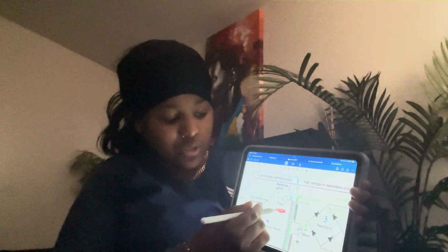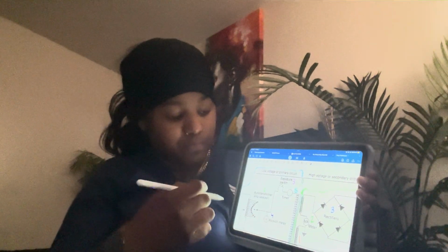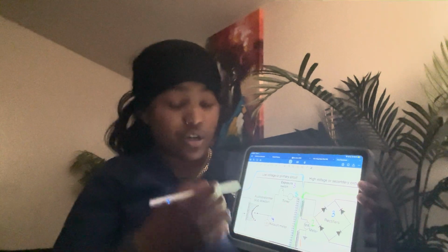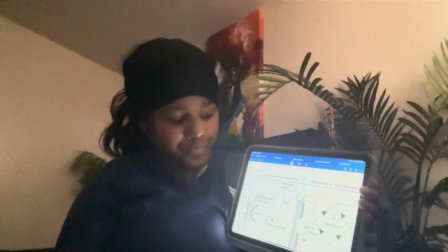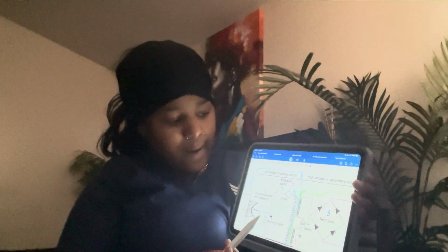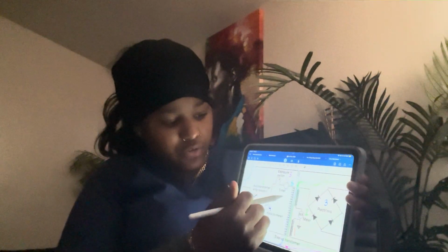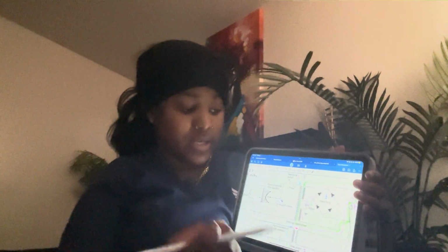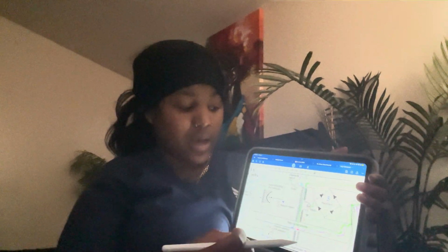This uses a capacitor charge resistor that allows us to determine the time for the exposure. So this is a wire that is going to run between the autotransformer as well as the step up transformer. Again, when that exposure button is pressed, the timer is what allows us to know how long that current is going to run through to project that exposure.